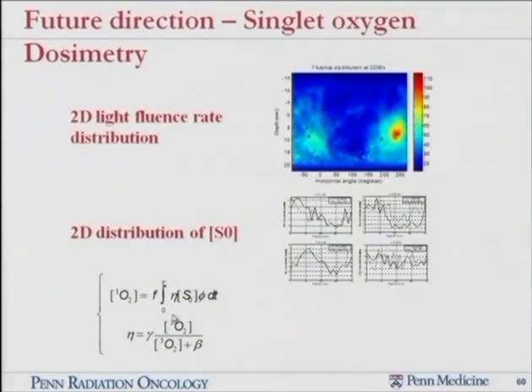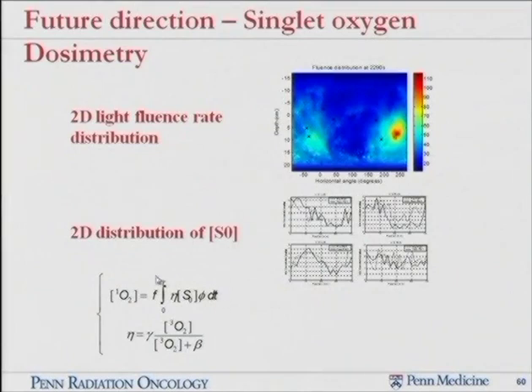We actually are using this methodology because we know this returns back to the PDT dose. So PDT dose has been a valid concept, used for a long period of time, a product of light and drug, and you want to make sure that a proper dose is given. So we basically just slightly modulate that with the sigma eta values. And the hope is really that this modification is not that drastic, and that we improve the dosimetry, taking into account the fluence rate effect.